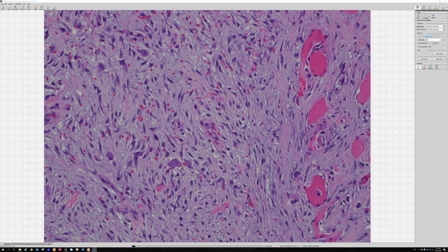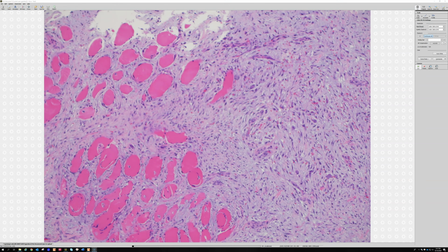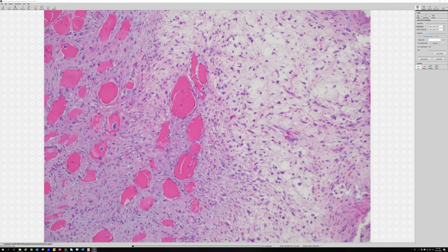and one that has caused many people to overdiagnose it as sarcoma. In fact, early in my career, I actually called a case that I thought was sarcoma, and it was just a really robust case of proliferative fasciitis, where all of those big ganglion-like cells, that's what we call those big cells that look kind of rhabdoid, were all packed closely together, and it wasn't in the muscle, it was in the subcutis, so I didn't have this clue to go on.